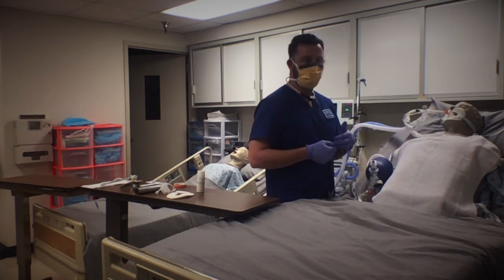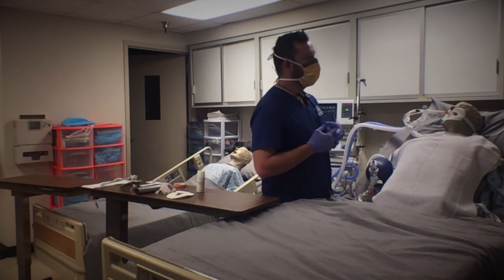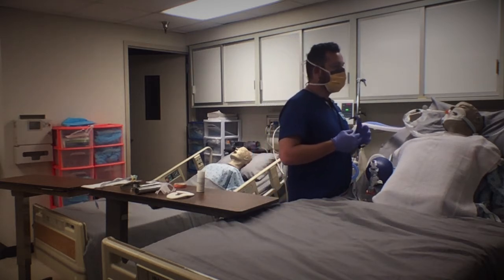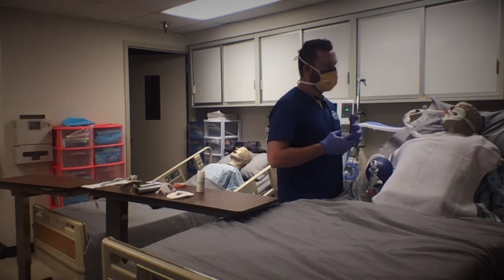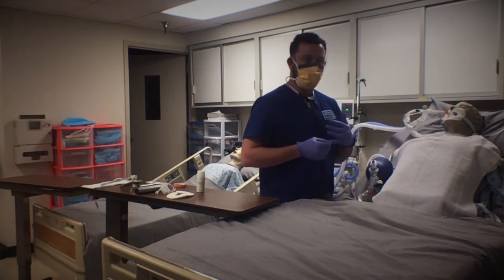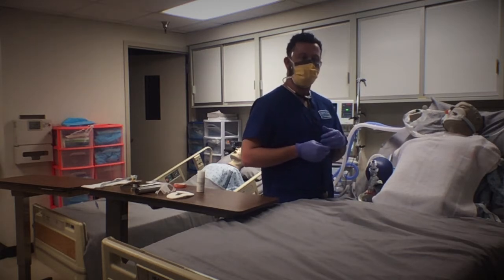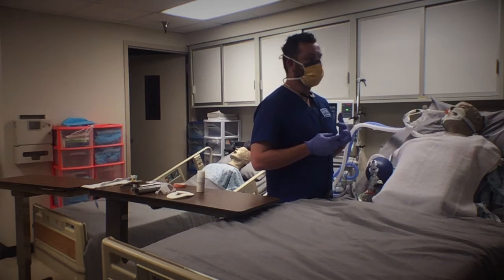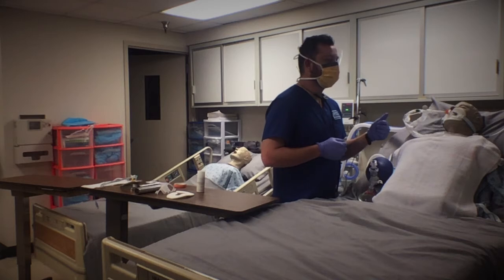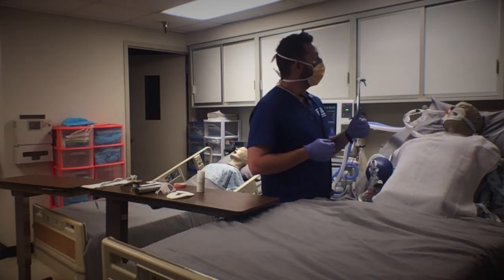A rare but serious complication associated with extubation is laryngospasm. Post-extubation laryngospasm is usually a transient event, lasting several seconds. If laryngospasm occurs, oxygenation can be maintained with a high FiO2 and the application of positive pressure. If laryngospasm persists, a neuromuscular blocking agent may need to be given, which necessitates manual ventilation or reintubation.